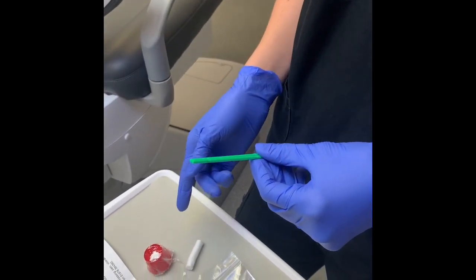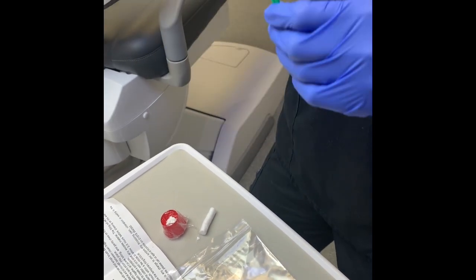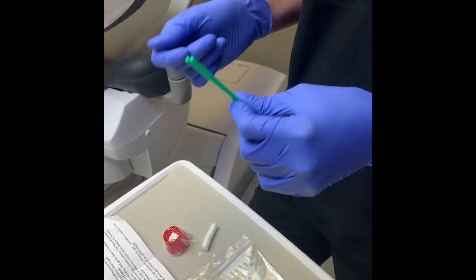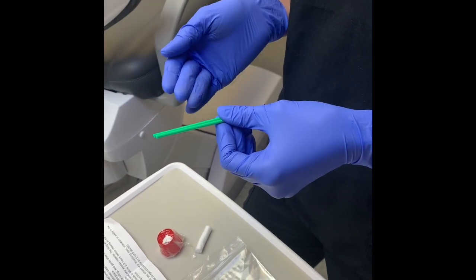When you're placing one of these fillings, we need to have a nice dry environment. Get yourself set up in front of a big mirror, get someone to help you if you can, with a really good light — a flashlight or ideally a smartphone light — which gives you a nice bright light so you can see what you're doing.